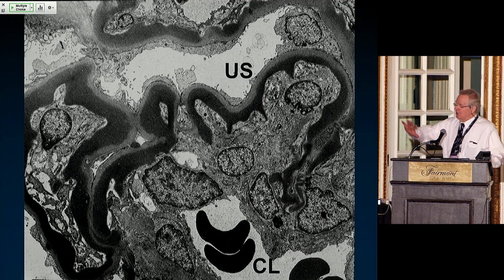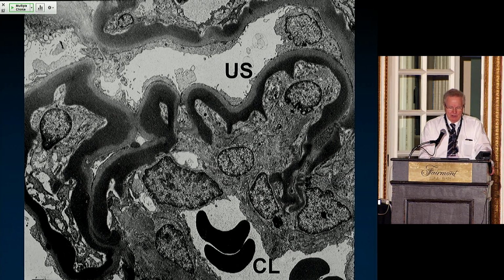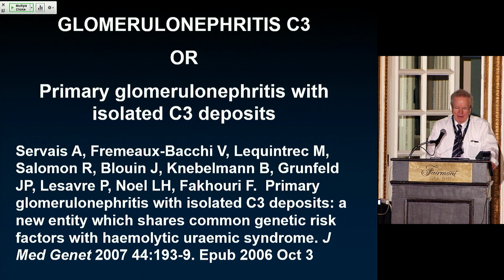This is the exaggeration, the pretty end-stage case of a patient, a nurse that at age around 50 became dialysis dependent with this dense deposit disease.